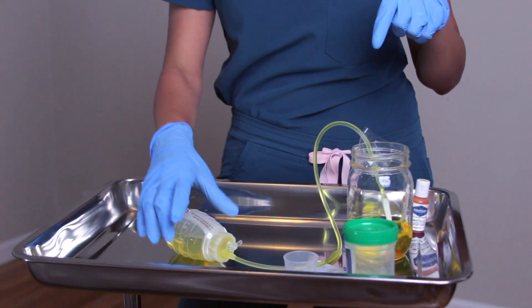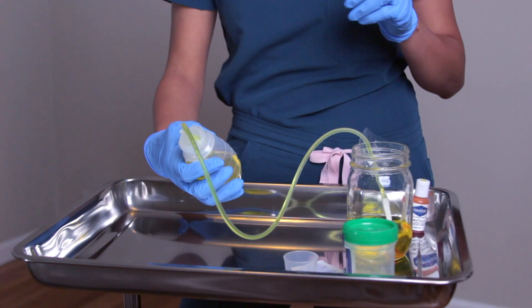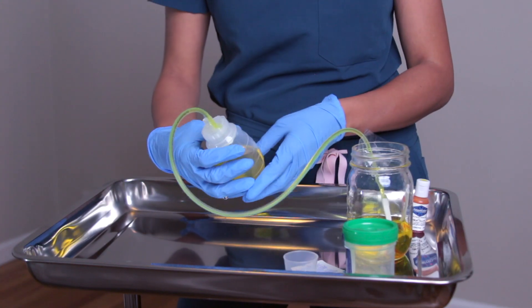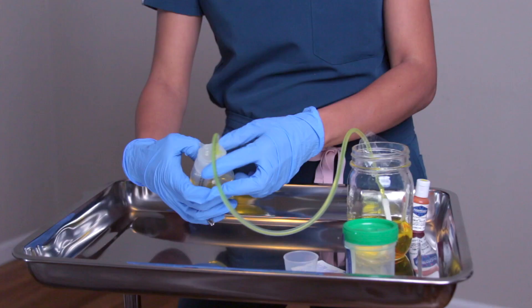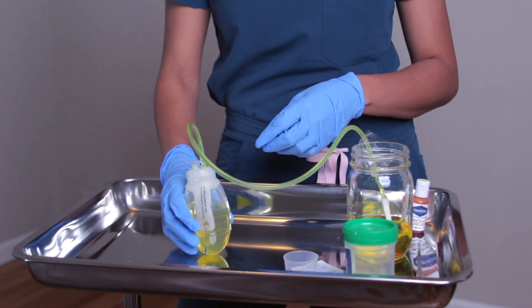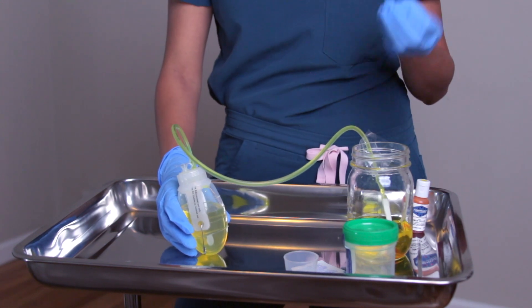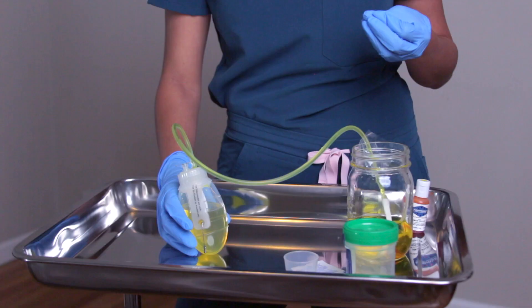Every facility has a different type of drainage output log. Make sure you document the time, date, and amount emptied — whether it was in the morning, mid-afternoon, or end of day. You always want to make sure your drain is emptied. If we look at the JP drain, you can see it is fully open and has a lot of volume in it — which tells us it's not at suction anymore. We need to keep a close eye on this and keep it to suction. Since it's full, we need to empty the contents.